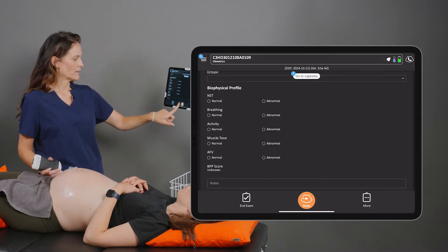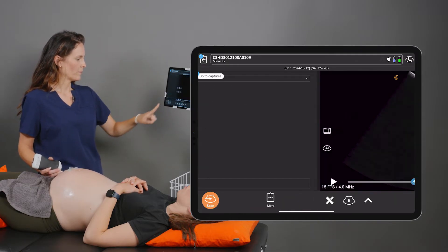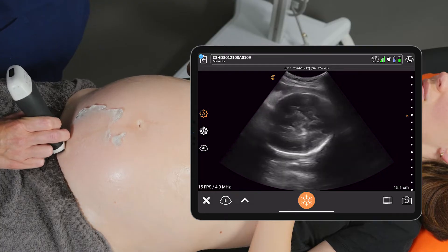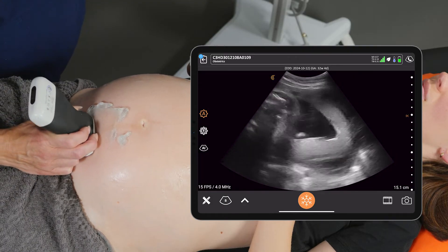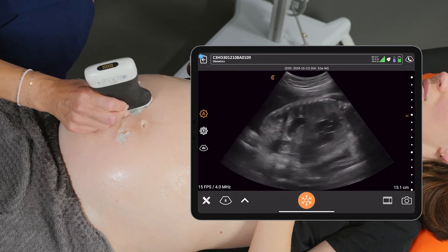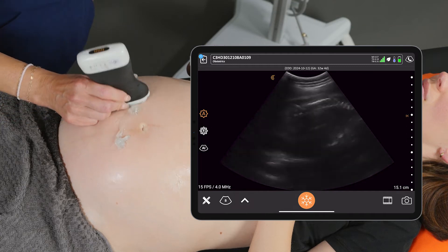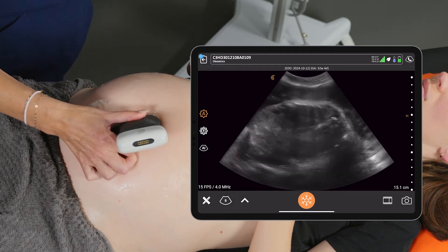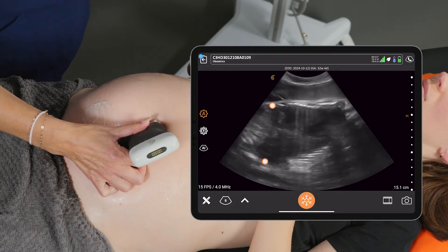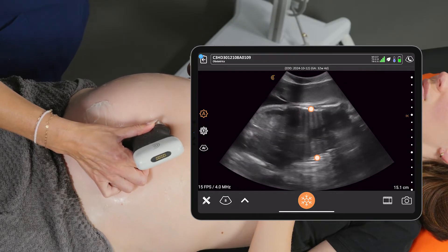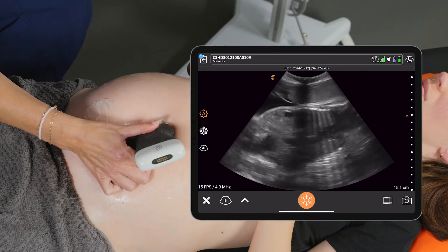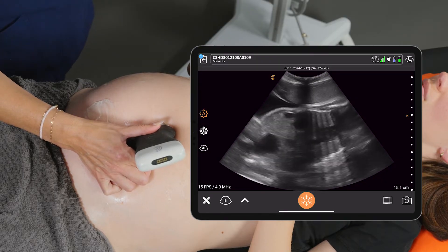We'll go ahead and start here. We can see that the baby is presenting cephalic, so the baby's head is down. We'll scroll up to the baby's abdomen and get a coronal view of the torso to see if we can start by assessing the fetal breathing.